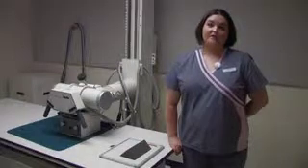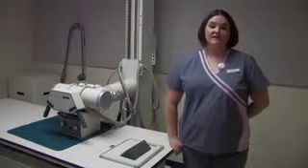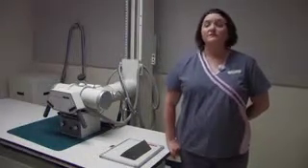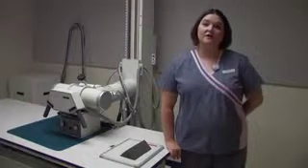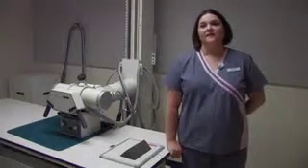Before you go get a patient, you will need to set up your supplies and your room. That includes having a 10 by 12 cassette, radiolucent sponges available, markers left and right, depending on which side you're going to be doing, lead apron, and tube.